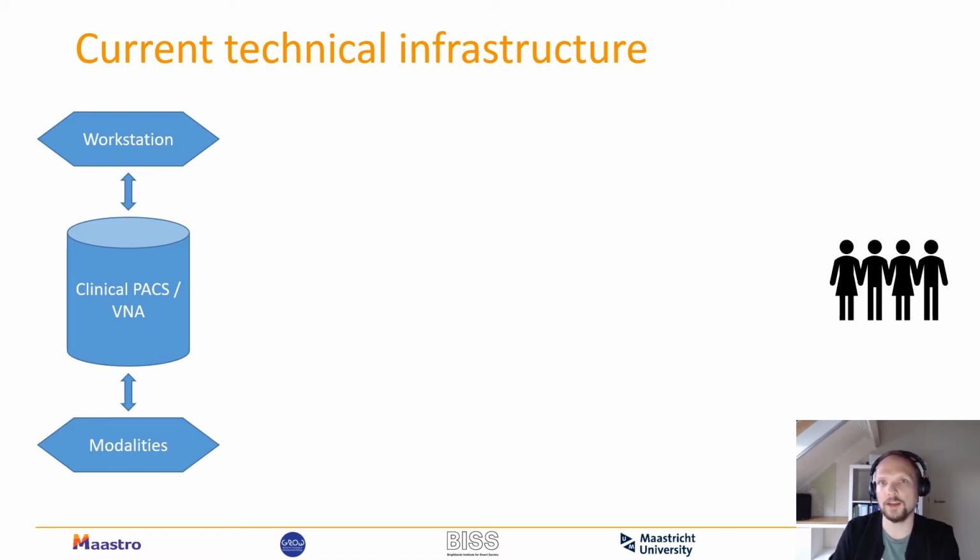Think about a CT scanner, a PET CT scanner, but also the treatment modalities themselves, because they're all using DICOM, the medical imaging protocol, to guide and steer those machines to deliver the actual radiotherapy. However, this is all on the clinical side of that data. It's not on the researcher side.